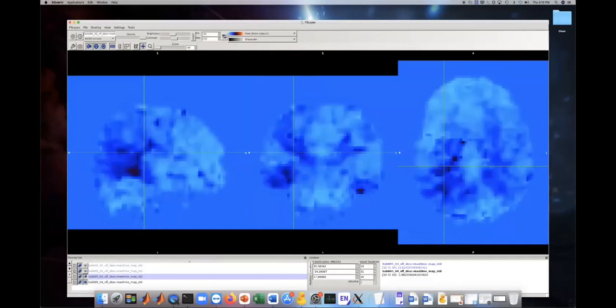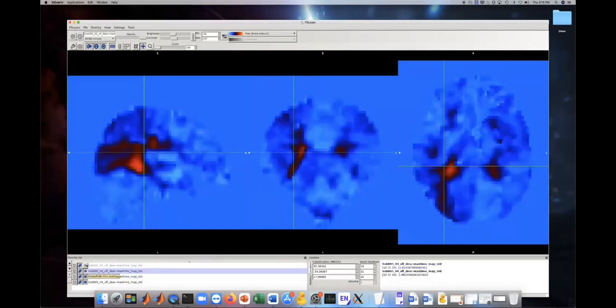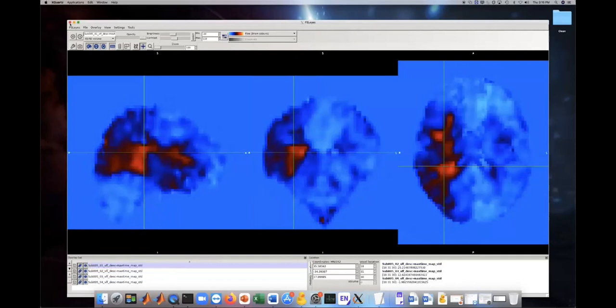If you noticed, there is a difference between the maps I show you here through FSLeyes and Tidepool, besides the color map I used. In Tidepool, there were parts of the lag maps which had gray parts with no apparent lag. These are the areas in which the fit of the correlation wasn't valid at a specific significance level, for example 0.01.